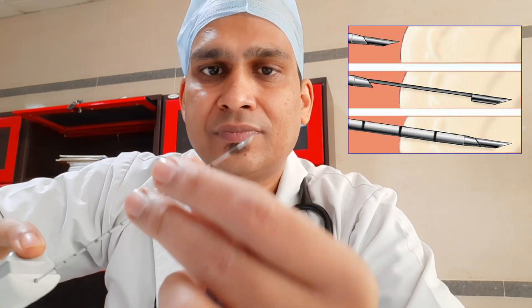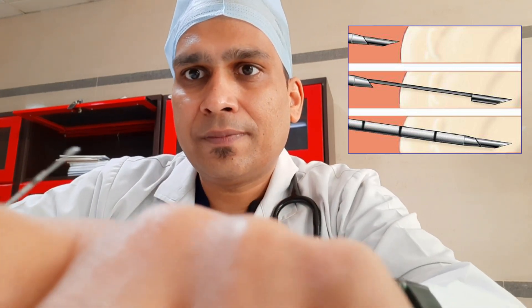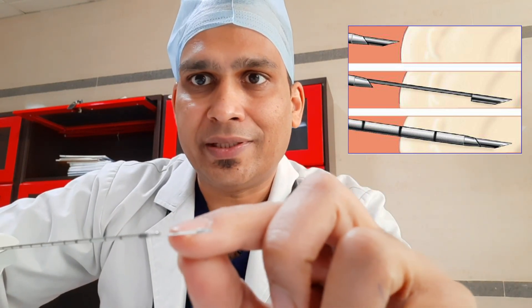Once we press the outer lever, the outer needle will come inside. This is the inner needle — you can see this is sharp, and this hollow area is the notch. The notch is 1.9 centimeters. The function of the notch is that the tissue you are going to take will get stuck in this notch, so the length of tissue will be 1.9 centimeters or less. The sharp tip is around 3 mm.